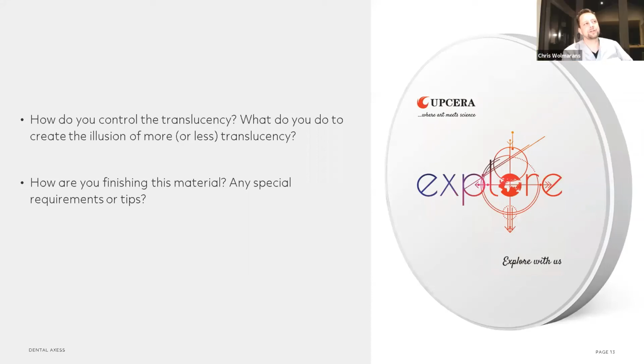We don't do speed sintering. We've got a protocol where we process our work, so we always end up with overnight sintering. For me, it's a way where we can maintain consistency and quality by keeping that consistent. So I don't opt for speed sintering. I try to avoid it and stick to the slower process, which is reliable, and it's been serving us really well.